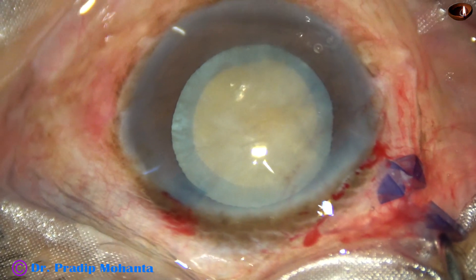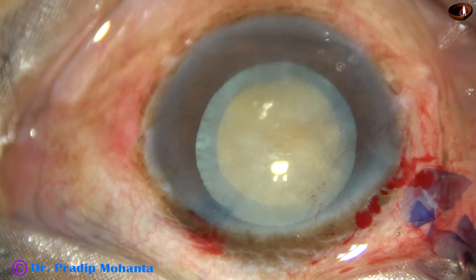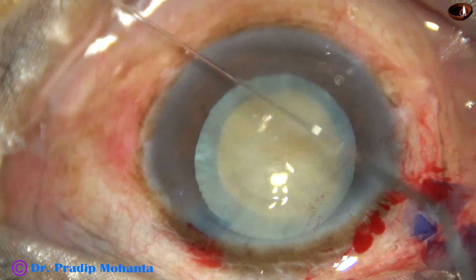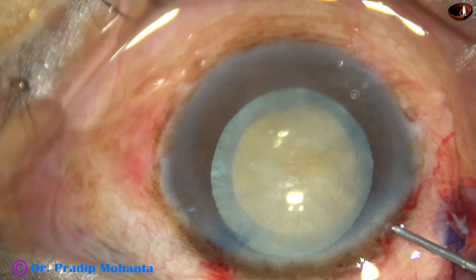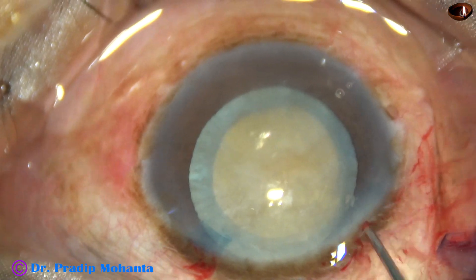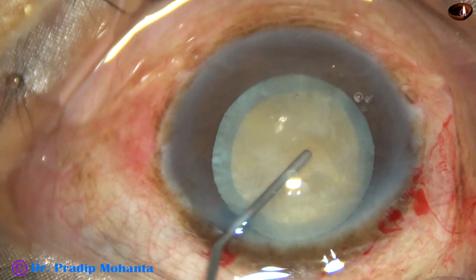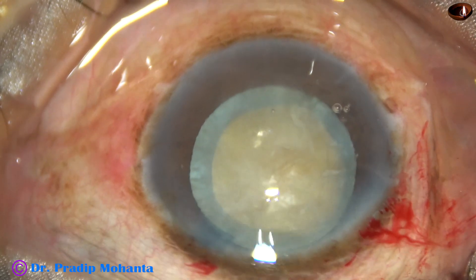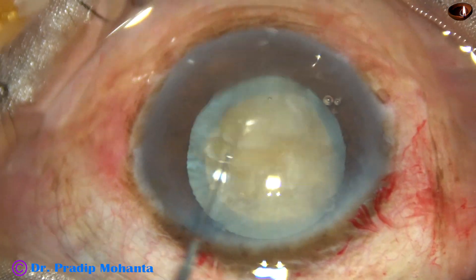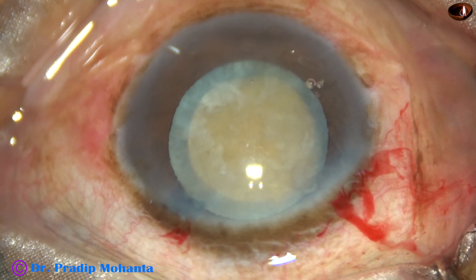Rhexis is done. Since it is a sclerotic cataract, the lens matter is firmly adherent to the capsule, so I have decided to do hydrodissection. Hydrodissection is being done at multiple points with small amounts of fluid injected at two to three points. This is the fourth point, and now the nucleus is gently mobilized — I find that the nucleus is nicely rotating.